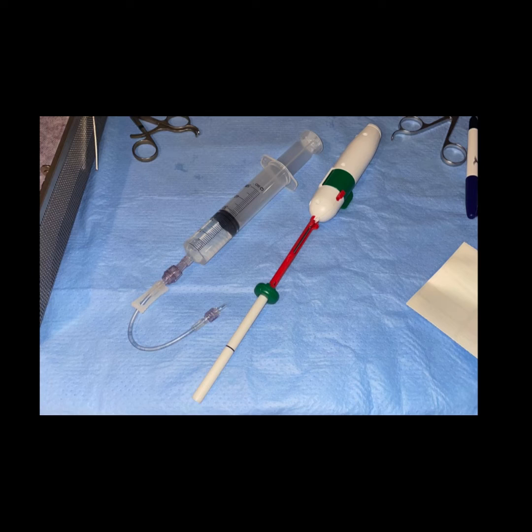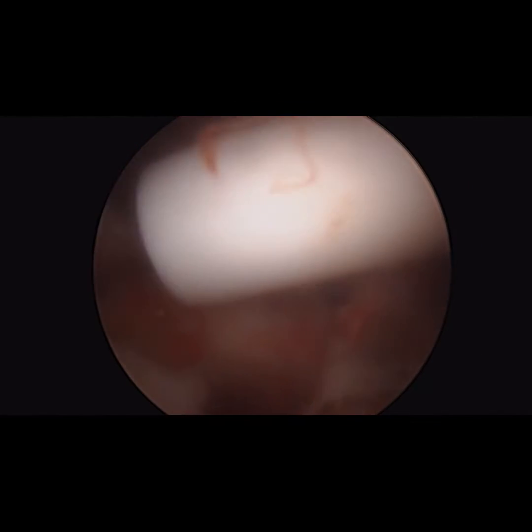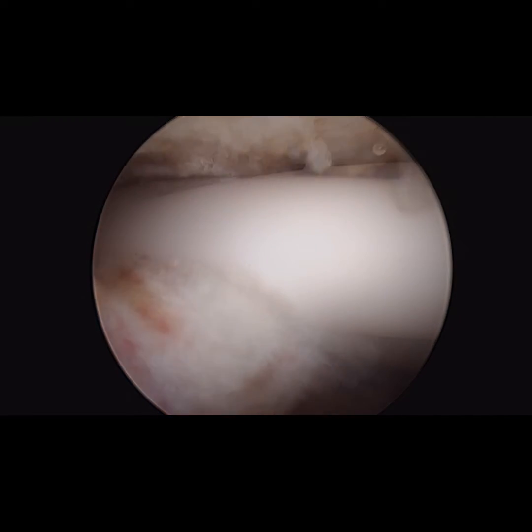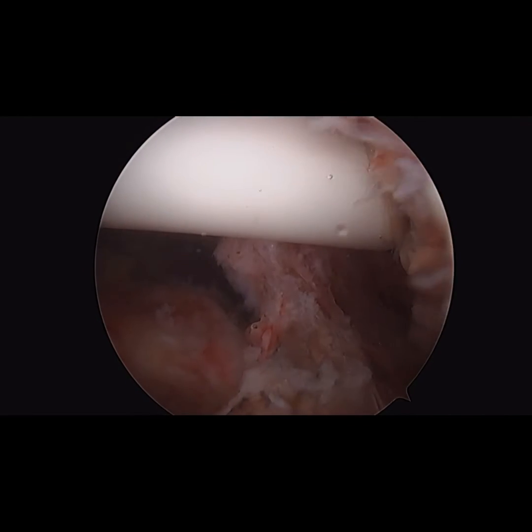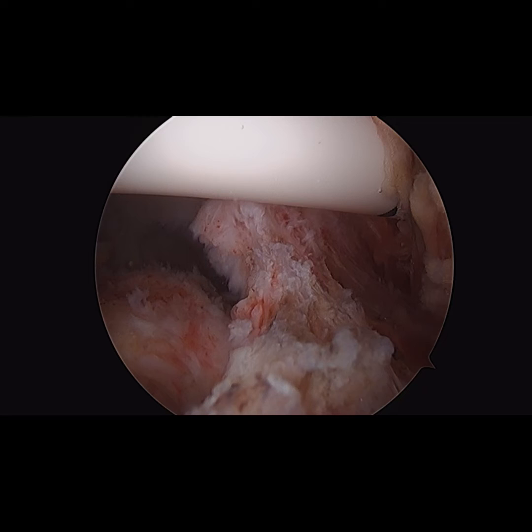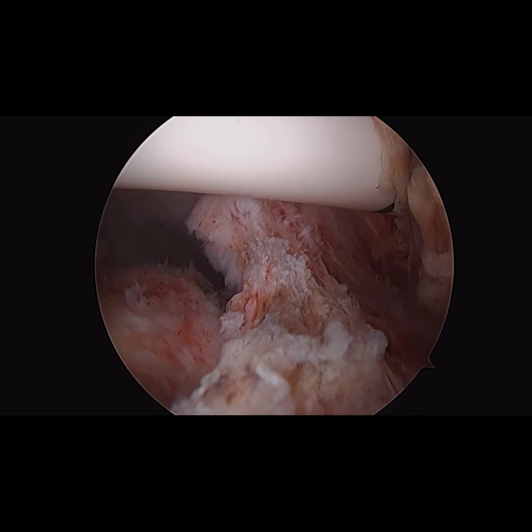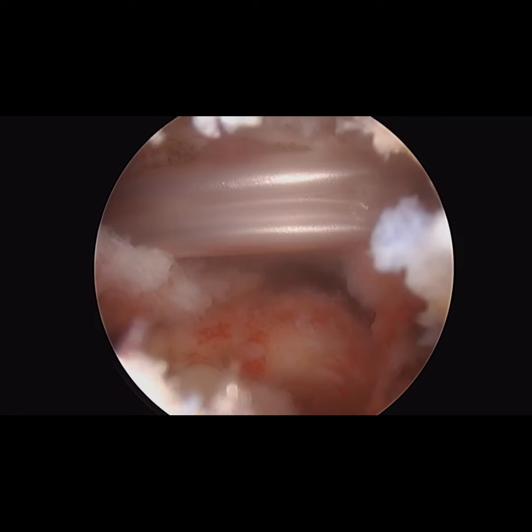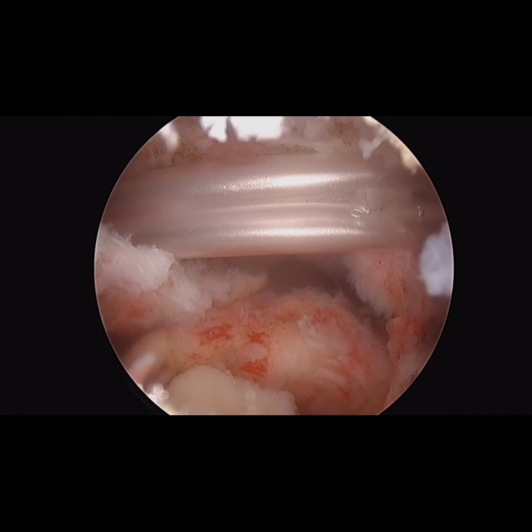The balloon is seen on the right, and on the left is a syringe of saline used to inflate the balloon once it is placed into the patient. The protective inserter is now brought into the subacromial space through a lateral portal. It is placed as medial as possible such that the black line is visible just at the upper right corner of the screen. Once I was happy with the position, the protective covering is removed, and this exposes the balloon.